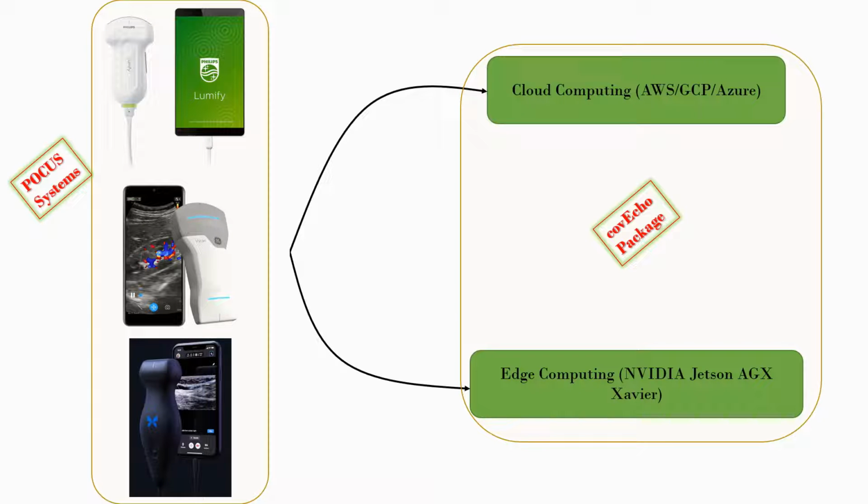So this forms not just the AI algorithm but a complete package, where we are even planning to deploy the algorithms for a legacy system which doesn't traditionally have cloud or mobile backend support. To the best of our knowledge, this is a first-of-its-kind effort in India where an automated algorithm with a complete package is being applied for lung ultrasound. There has been some work in CT and X-ray, but this is the first of its kind for ultrasound.